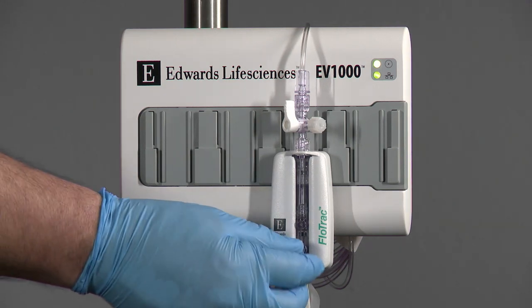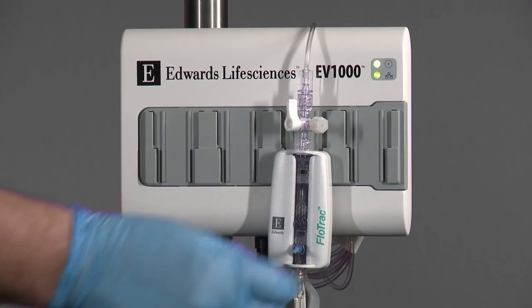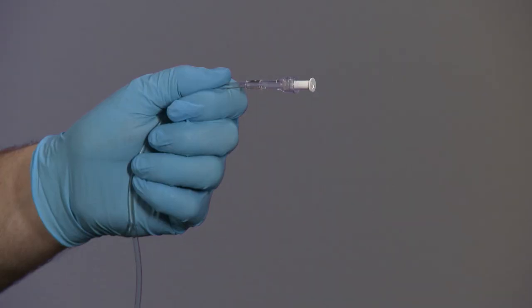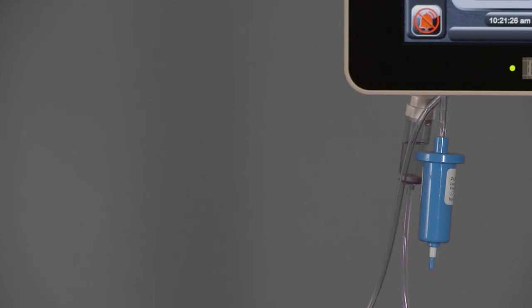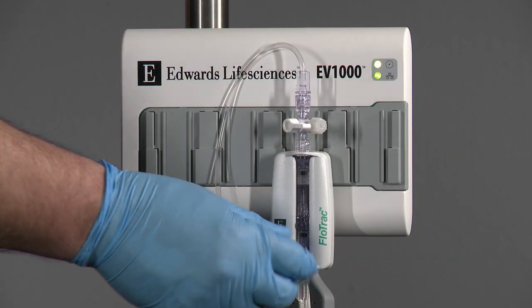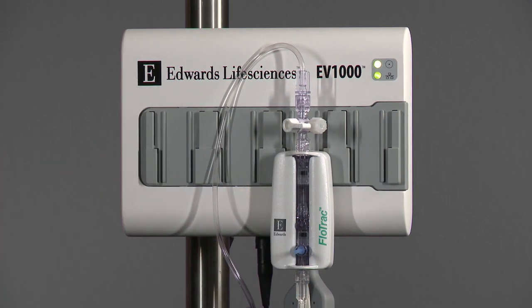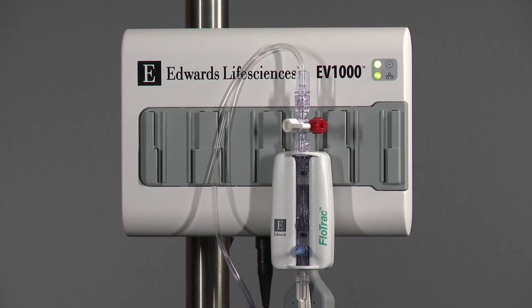Pull the flush tab and prime the FlowTrack sensor through to the vented cap just above the sensor, evacuating all air. Turn the stopcock toward the vented cap and flush to the end of the pressure tubing while holding the pressure tubing upright. Pressurize the infuser bag to 300 mmHg. Pull the flush tab for a fast flush and evacuate any residual air. Replace all vented caps in the system with non-vented caps. The above best practice in priming the system will mitigate residual air bubbles.